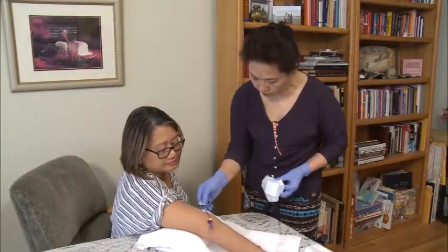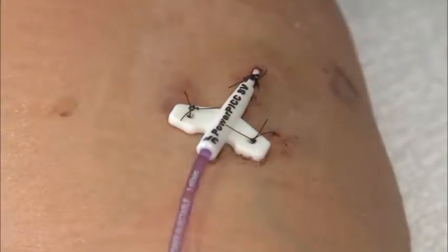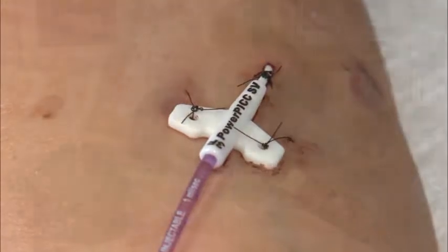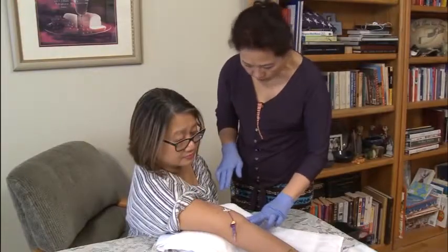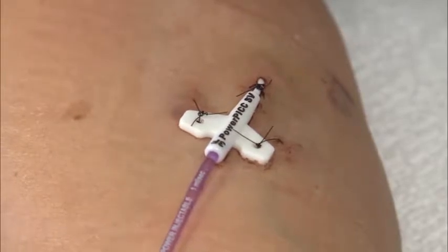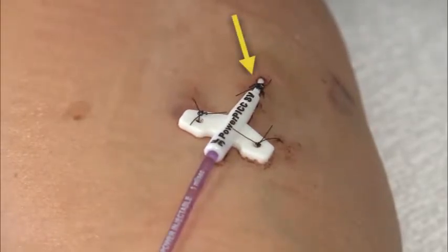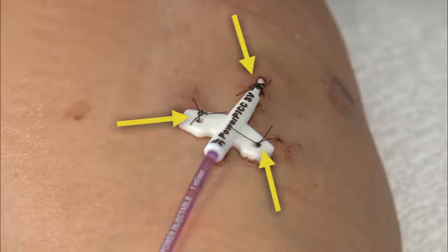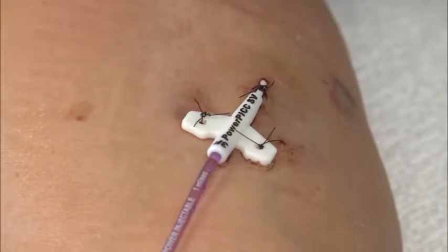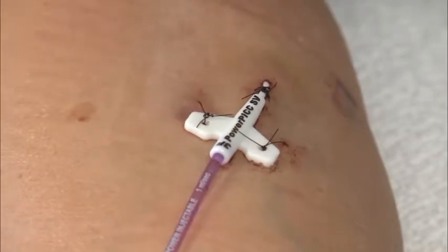Now check the insertion site. Look for redness, swelling, pain, or discharge around the catheter insertion site. Next, check the stitches. The stitches hold the catheter in place. There are usually 3, the site stitch and 2 wing stitches. All 3 must be intact and in the skin. If you see any problems, finish changing the dressing and then call your doctor or infusion therapy nurse.